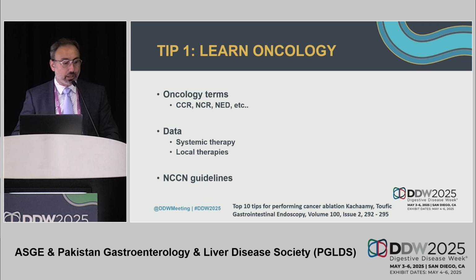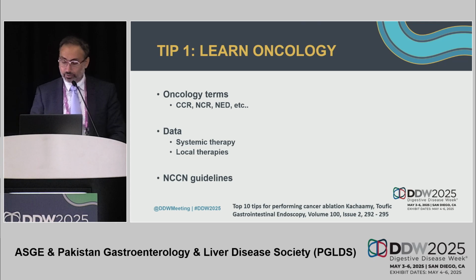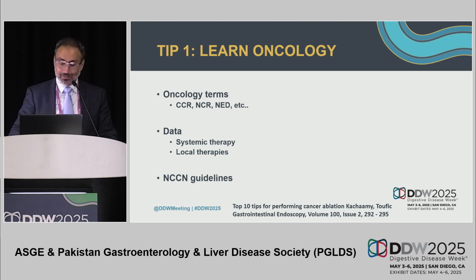One of the benefits that we have as gastroenterologists is access to the GI tumor itself, and often our modalities, cancer ablation included, are safer because we are not traversing other tissues. For example, when people are treating pancreas percutaneously, they have to go through the liver or other organs, which increases the adverse events of their modalities, versus the same modality developed endoscopically is typically safer, and that has been shown through different modalities.